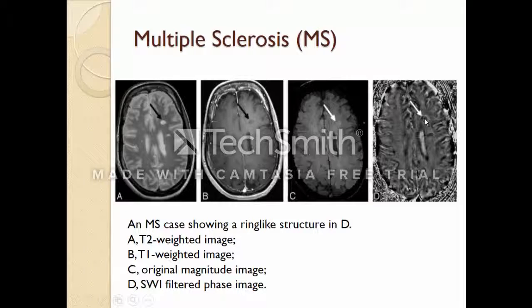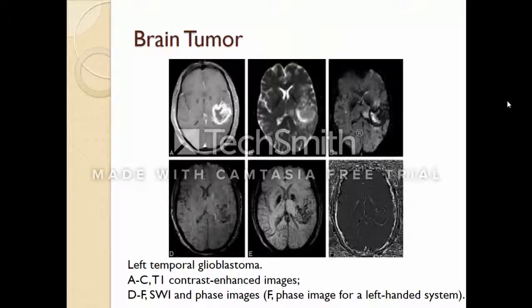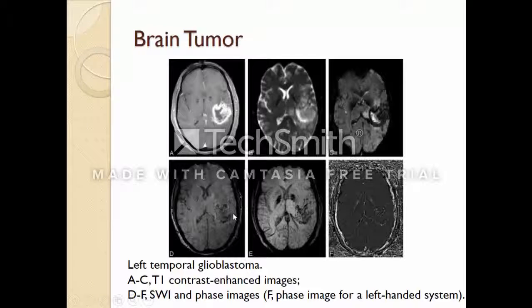When it comes to tumors, MR spectroscopy, diffusion imaging, and perfusion studies have also made significant contributions. Regarding the diagnosis of brain tumors, SWI is equivalent to T1 contrast enhanced imaging. This figure shows an example of a left temporal glioblastoma. In all photographs, the boundaries of the tumor are visible, but SWI gives more detailed information on the internal architecture of this tumor — for example, you can see the details here and here.